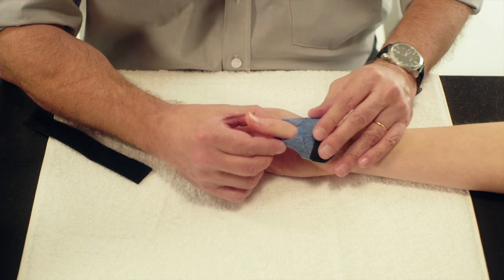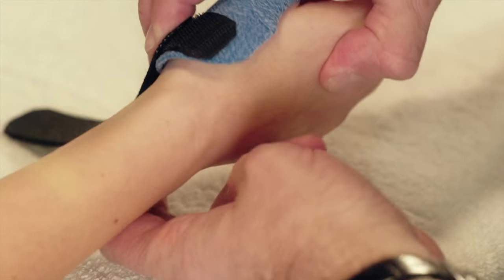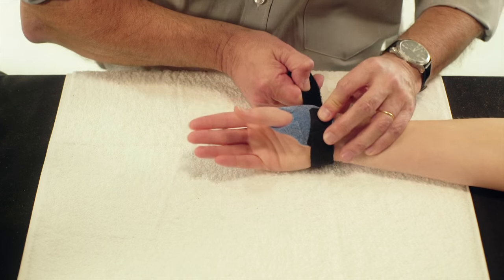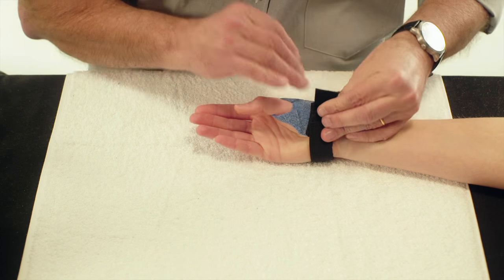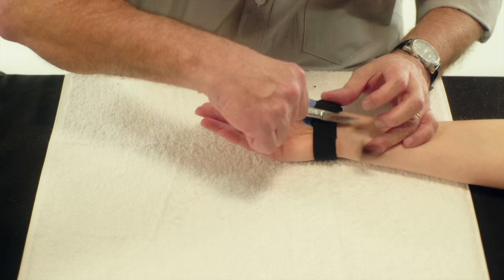Try the orthosis on. Position the orthosis by applying a band of 25 mm wide elastic loop tape to the hook tape while rounding the base of the hand. Round the edges of the loop tape.